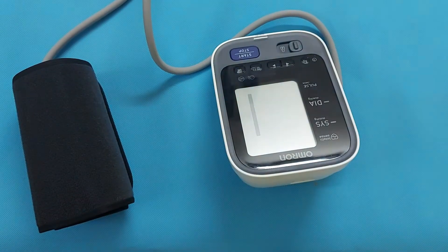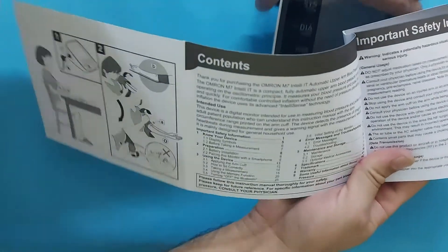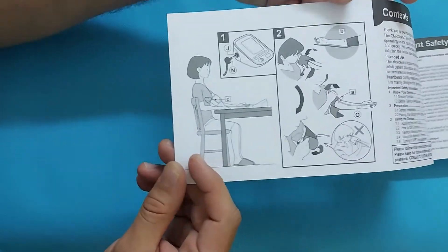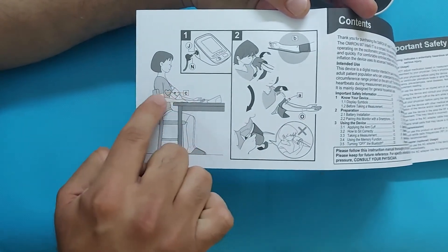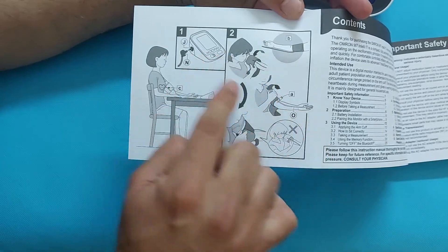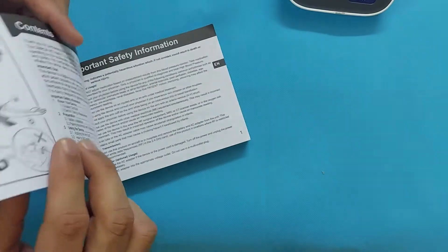Let me show you how to measure blood pressure with this digital blood pressure monitor. First, sit on a chair — as mentioned in the booklet, sit on the chair and keep the device in front of your table. Make sure the arm cuff is level with your heart, as shown in the picture. For the left hand and the right hand, the arm cuffing technique is different, which I will show you next in this video.